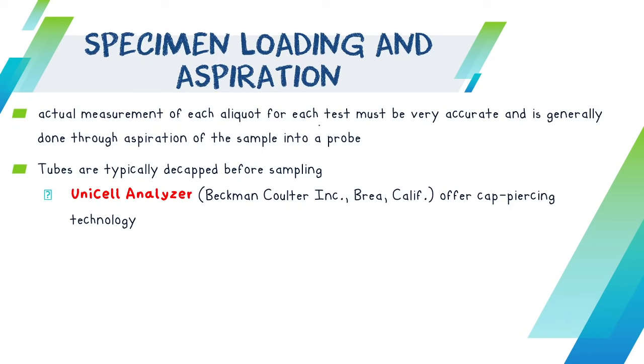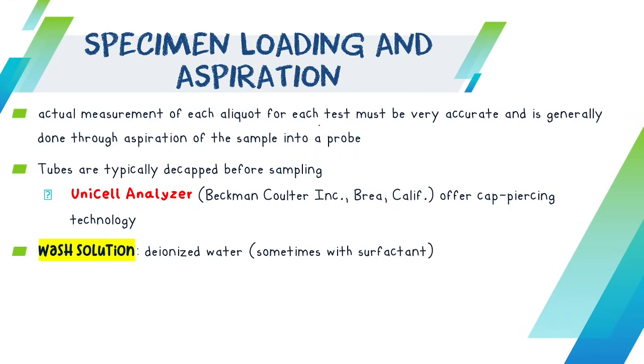There are also machines na you do not need also actually to mix your samples. Siyempre, upon collection, mix gyud na kadali. But by the time that you will process it in the machine, dili ninyo kailangan na i-mix og usab kay there are machines na sila na pud mismo ang naga-mix og balik sa inyong mga samples.